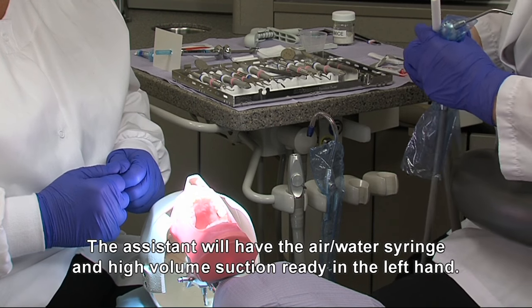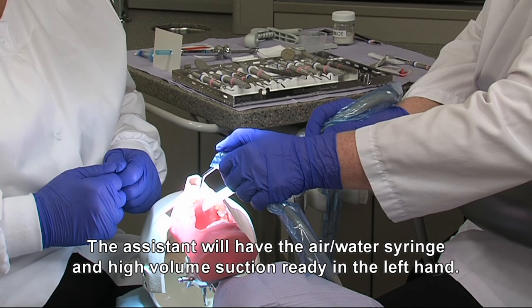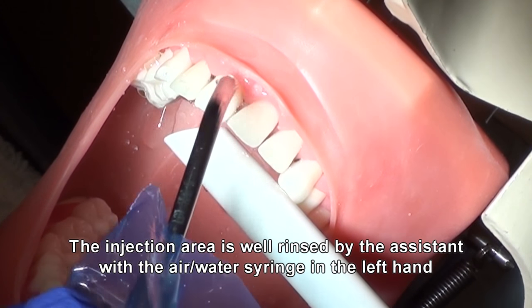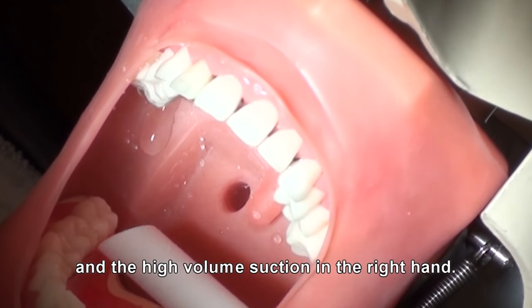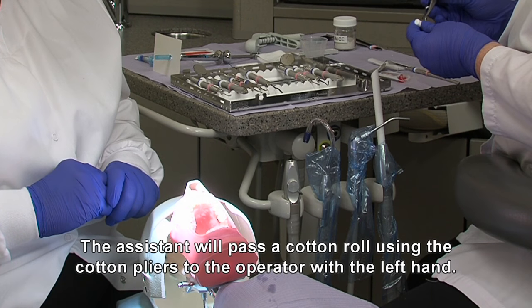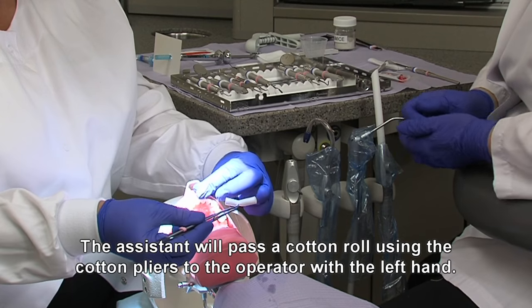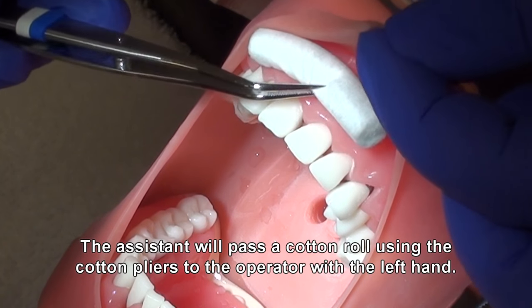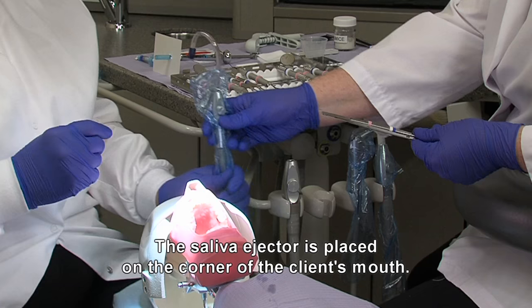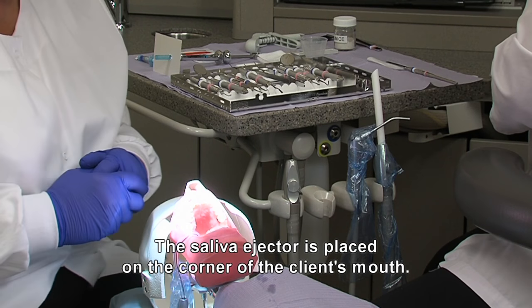The assistant will have the air-water syringe and high-volume suction ready in the left hand. The injection area is well rinsed by the assistant with the air-water syringe in the left hand and the high-volume suction in the right hand. The assistant will pass a cotton roll using the cotton pliers to the operator with the left hand. The saliva ejector is placed on the corner of the client's mouth.